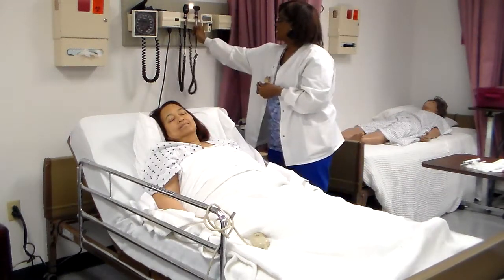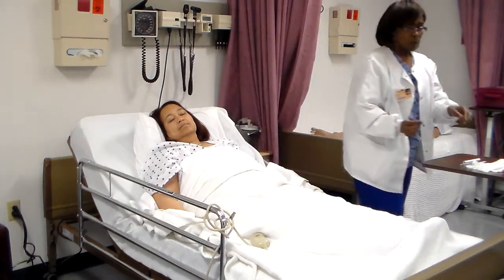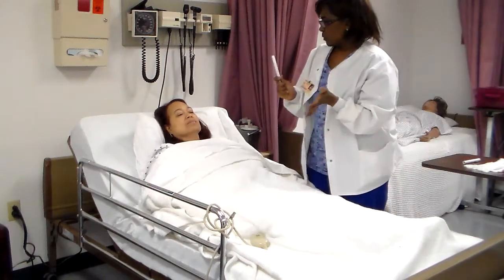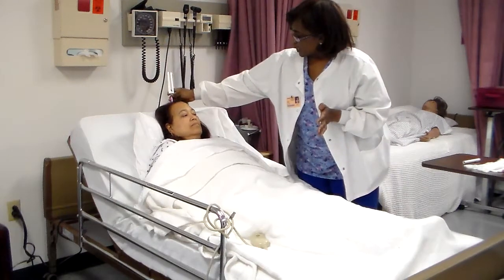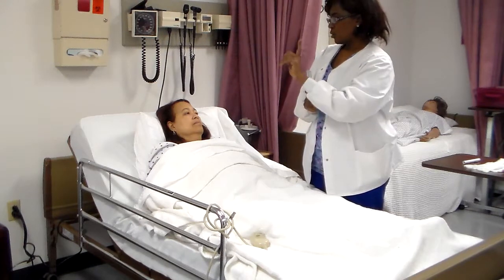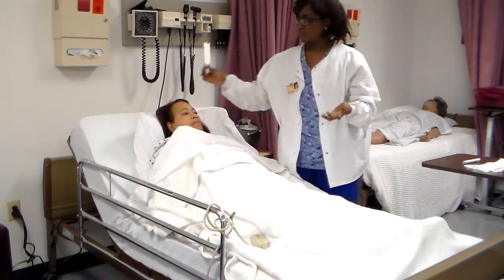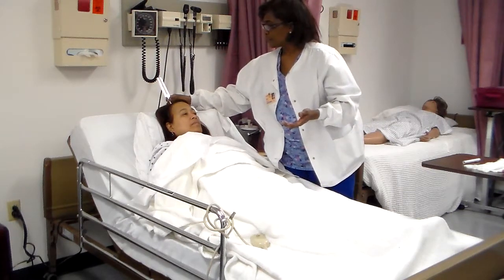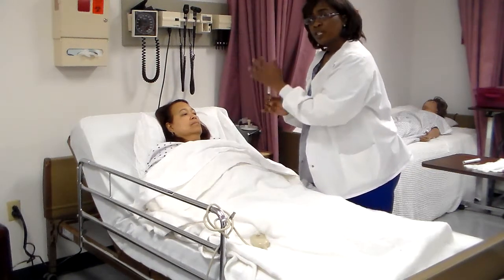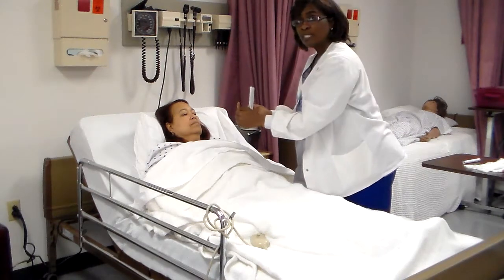Weber's test and Rinne test. At this time, we're going to do the Weber's test. With the Weber's test, you're going to instruct the client: Ms. Rivers, I will put this tuning fork on the top of your head. You're going to feel a vibration. When you no longer feel the vibration, I want you to hold your hand up for me, okay? Okay. Ms. Rivers should have been able to feel this vibration equally on both sides.